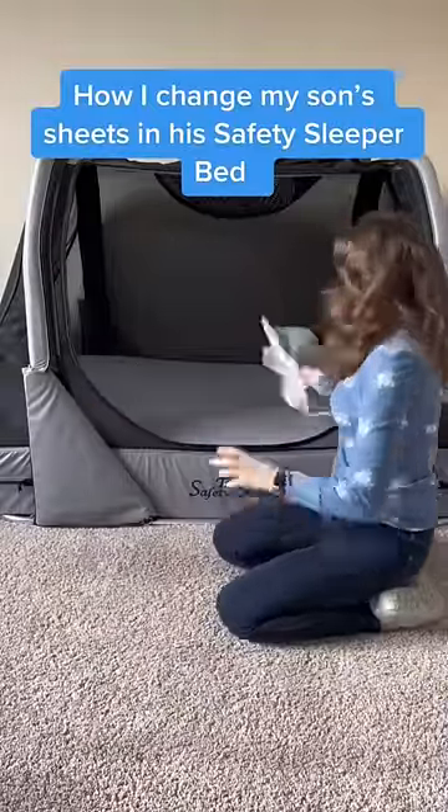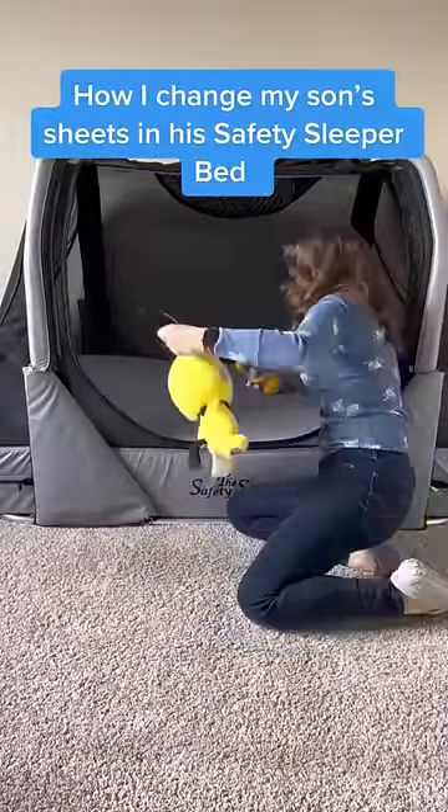This is how I change my son's sheets in his safety sleeper bed. What's really cool about the safety sleeper bed is that the sheet is actually attached to the bed.